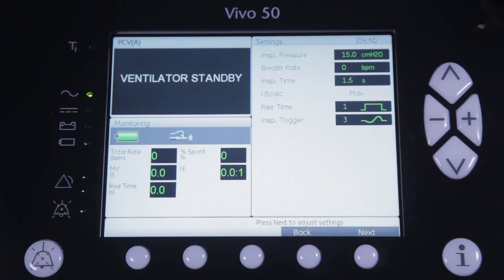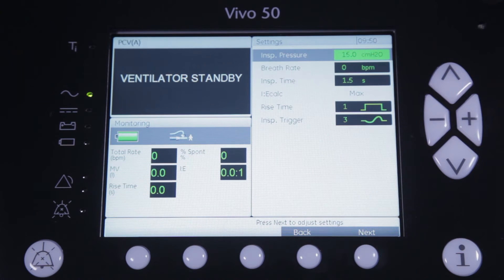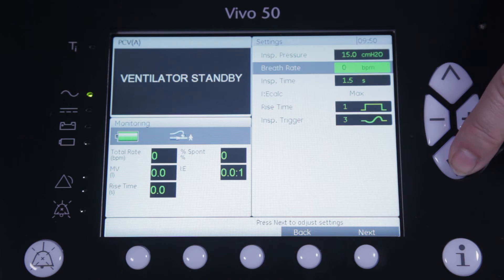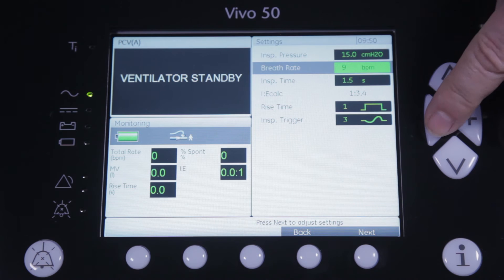First you select the pressure you want to deliver to the patient — in this case we've chosen 15 cm of water. Next, you can either choose to leave the breath rate at zero so that the patient will trigger every breath as desired, or set a certain mandatory breath rate. In our case we will leave the rate at zero and let the patient decide when to take a breath.